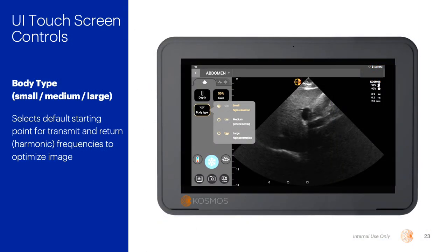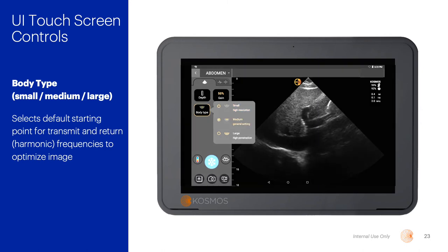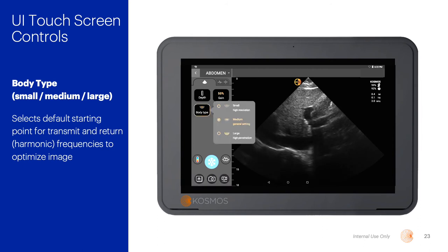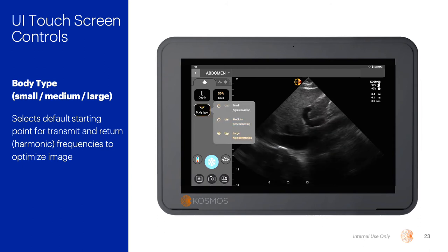There are several controls that can help us with the attenuation of the acoustic signal. The first is called body type, which has three settings: small, medium, and large. When this control is adjusted, the transmit frequency is either raised or lowered depending on which selection you employ, as well as the receive frequencies or the level of harmonics that the system will use to interpret the receive side of the signal.